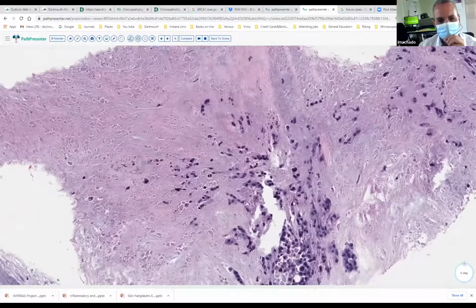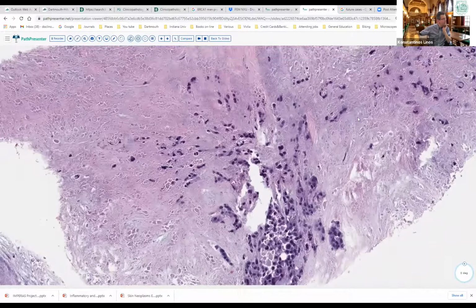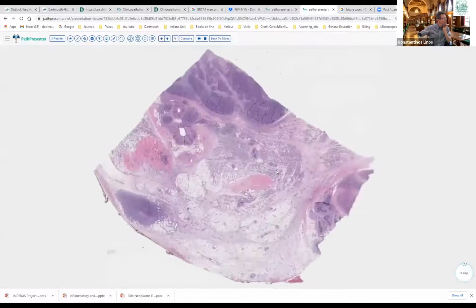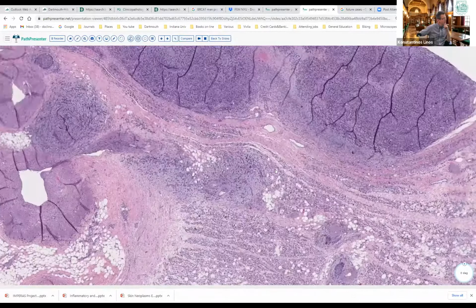Yes. So again, a lot of hyperchromatic cells, a kind of nesting and a little bit of solitary cells. Let's go to the excision. Then we'll have the excision, and that's an elbow mass. You see kind of fibrous tissue here, and you have some very well-defined nests and bigger areas. So let's go see what we have here.